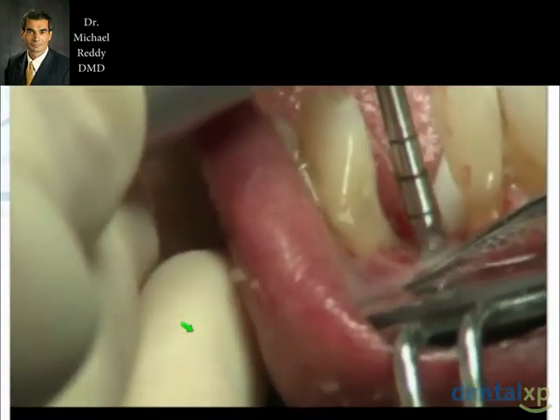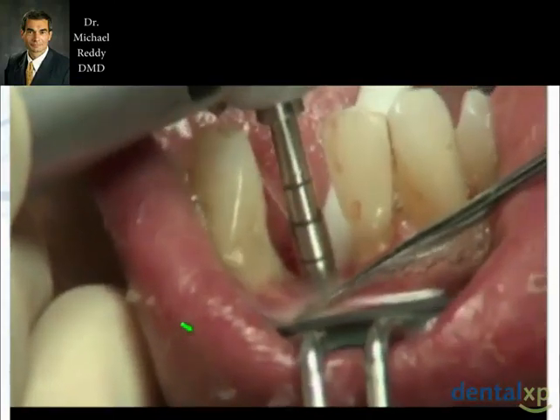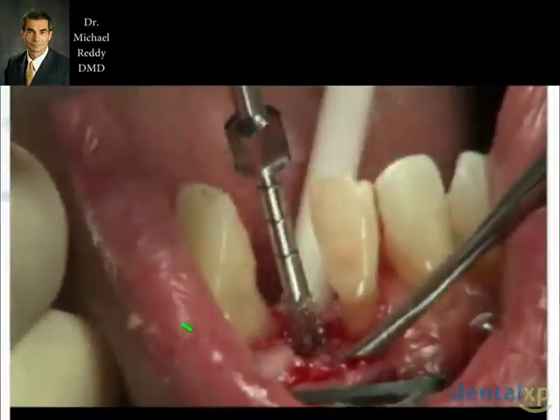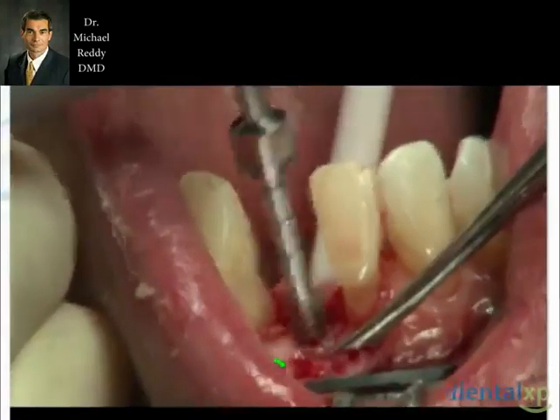Coming down to length on this implant. Now, in the maxilla, I would probably stop 99% of the time at the 2mm drill and go ahead and place the implant using the 2.5. Now we're going ahead and using a bone tap.